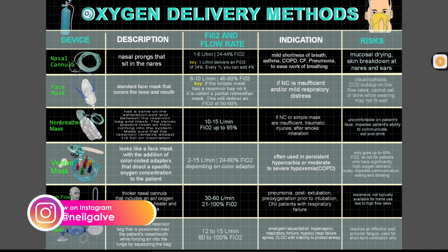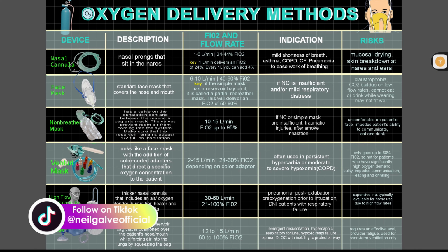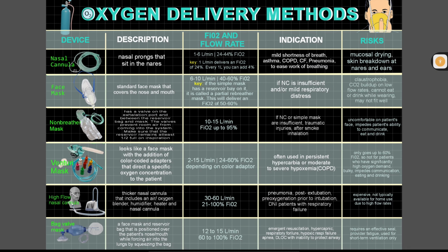Now, just a brief overview. We all know the importance of oxygen to maintain homeostasis, the state of balance in our patient's body, and oxygen is converted to ATP to serve as a source of our energy. That's why our main goal is to make sure that the patient is receiving the right level of oxygen, with their O2 saturation and ventilation at the topmost and highest priority.